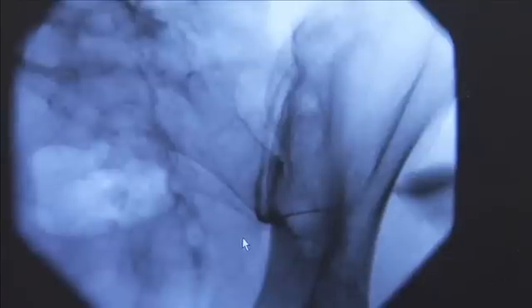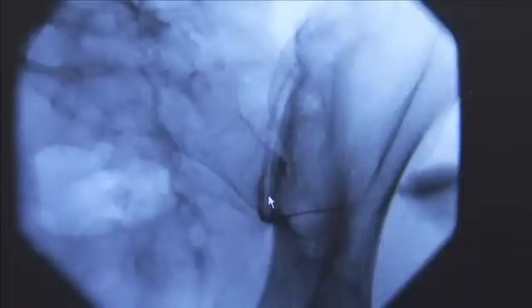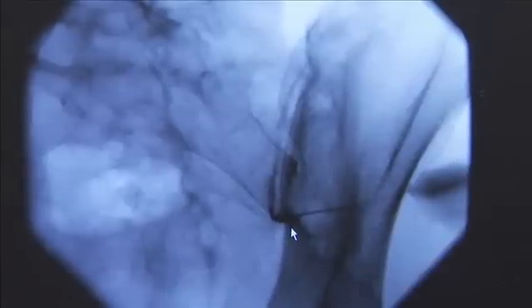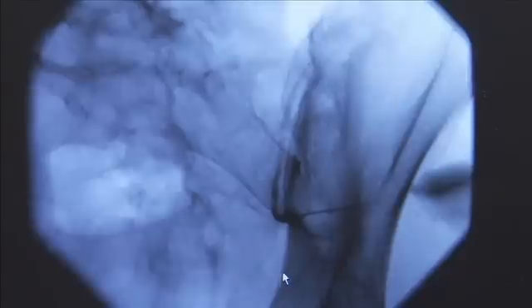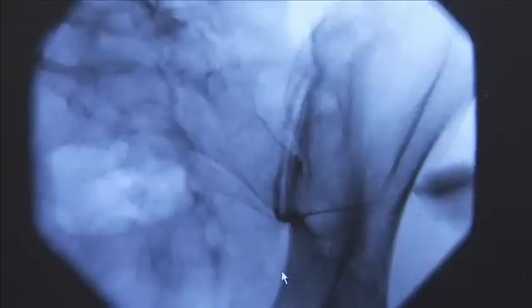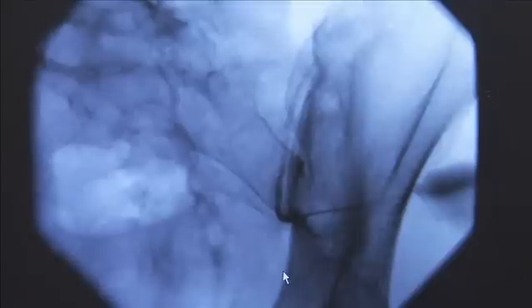Moving to the lateral view, you can actually see the medication extravasating into both the posterior and anterior SI joint. You can also notice on this view that the medication is not leaking out of the joint, which tells me that when I inject this numbing medicine, I don't run the risk of developing a false positive diagnosis or anesthetizing the L5 nerve root, the S1 nerve root, or the lumbosacral plexus. In the oblique view, once again you can see the medication nicely going along the anterior SI joint and along the posterior SI joint.